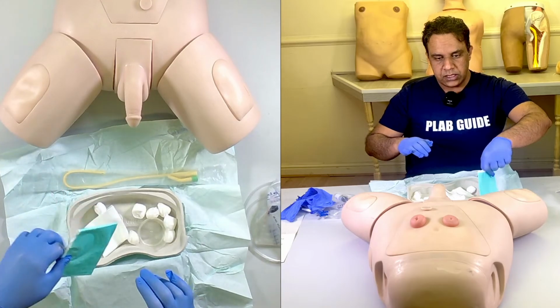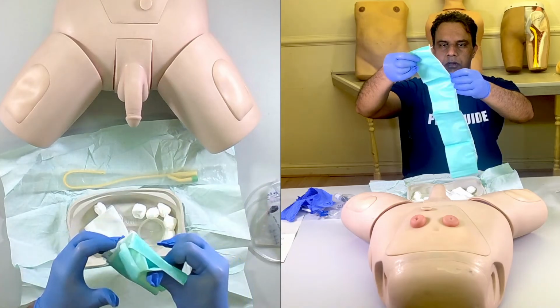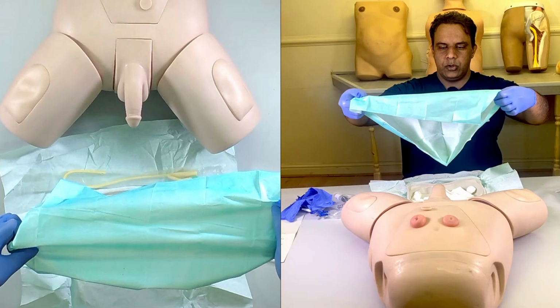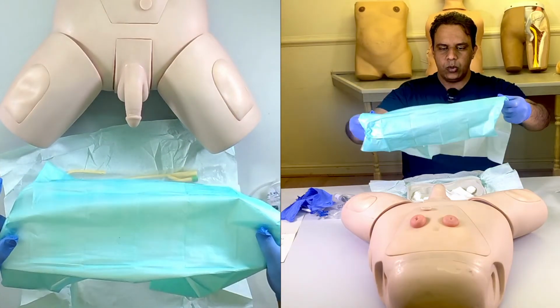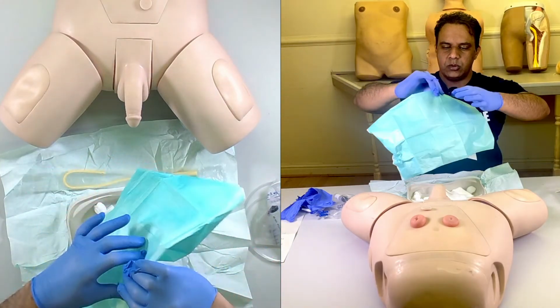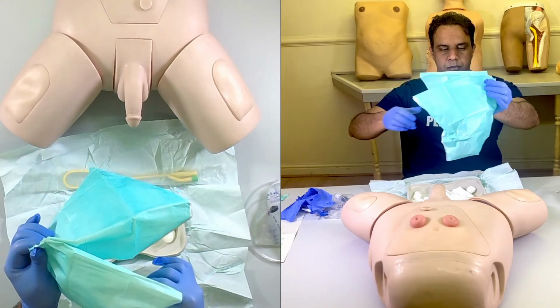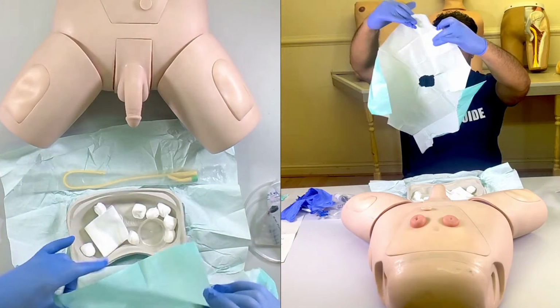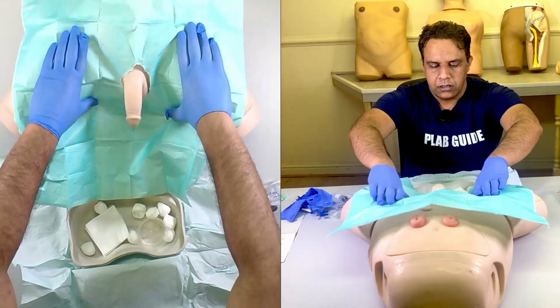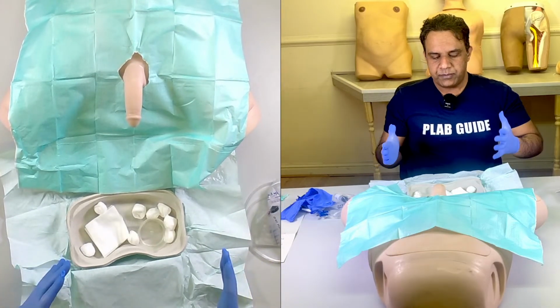Now the next thing I want to do is make sure that you drape the patient. You may get a sheet like this with no hole, or there may be a sheet with the hole in the center. If there is no hole, you can make a hole in the center so that you can put it on the patient. Put it like this, making sure that you do not touch the non-sterile area of the patient at all.